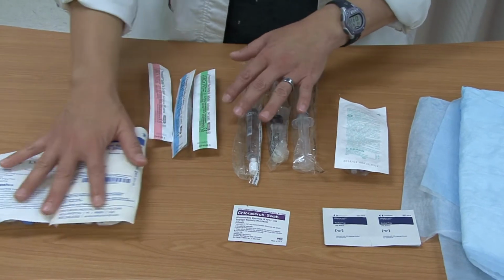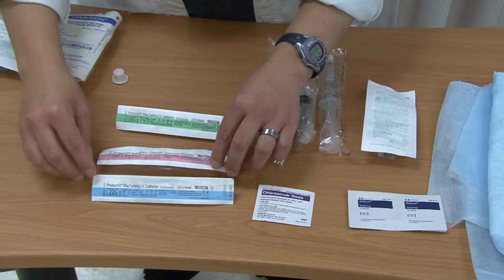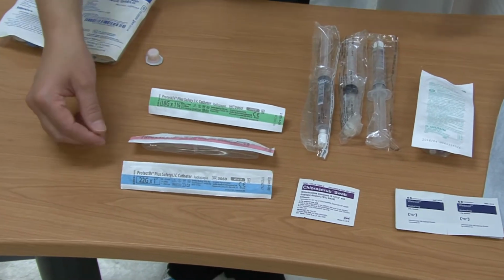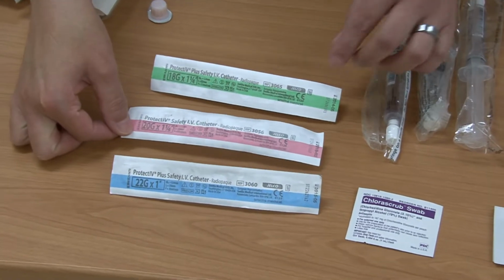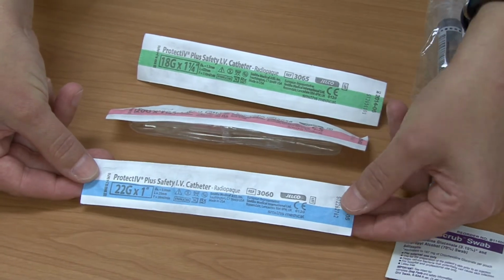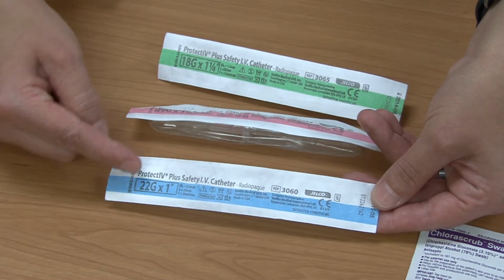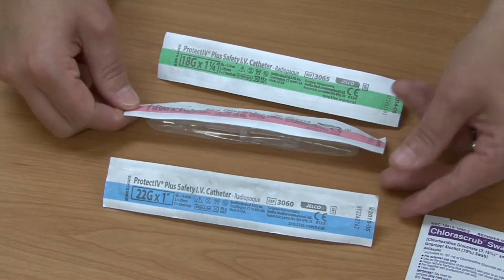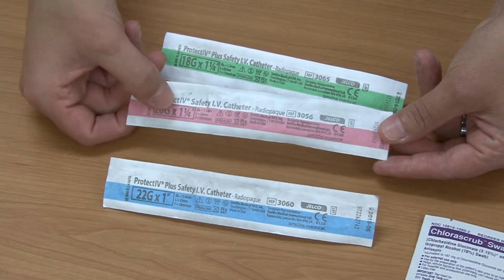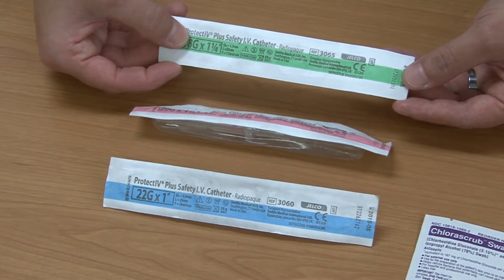Some other things that you might need would be the actual IV catheters, and so I'm going to show you these here. These are consistent with some of the agencies that we currently do clinical at. So for instance, if you look at this one, you'll see that they're labeled by color. This one is indeed a 22 gauge and it's 1 inch long. This one is a 20 gauge and it's 1 1/4 inch long. And this one is an 18 gauge and it's 1 1/4 inch long.